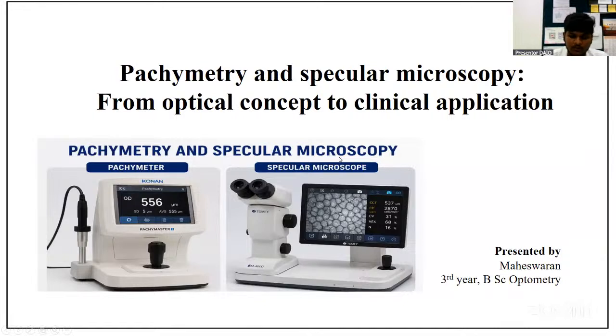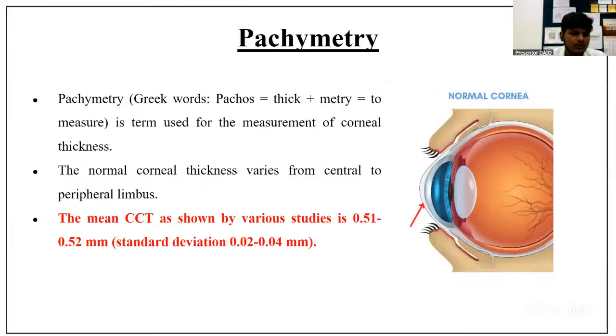So now we are going to speak about the topic, pachymetry and specular microscopy: from optical concept to clinical application. So now we can see about pachymetry. Pachymetry is a term used for the measurement of corneal thickness.